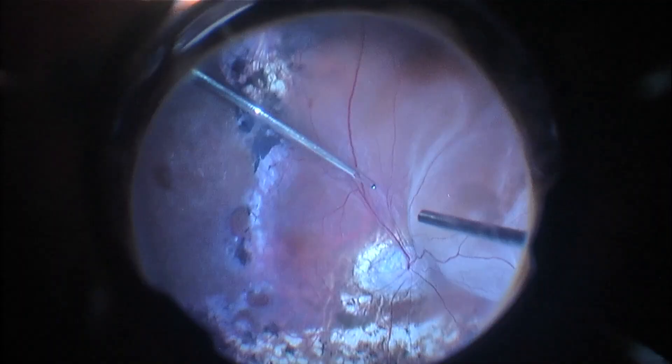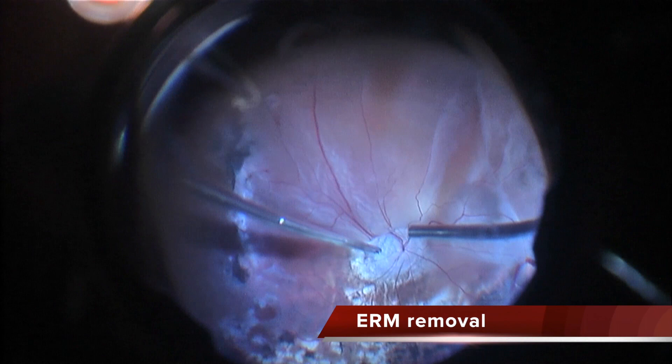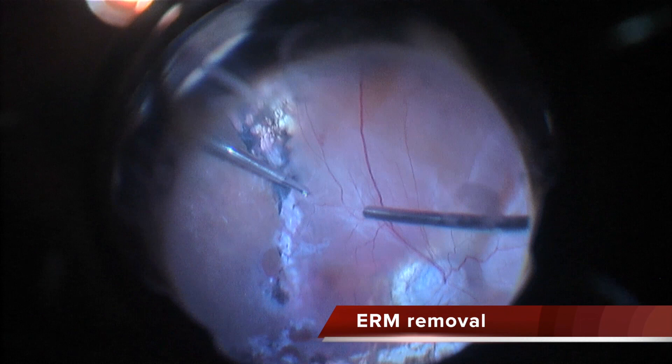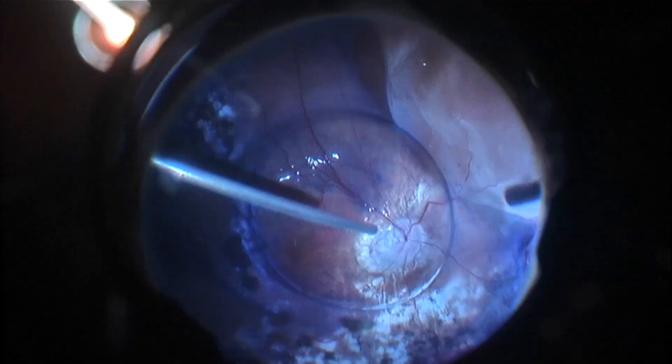In the inferior part of the retina, the retina is attached and there are still vitreous remnants. Unfortunately I cannot remove them without tearing the retina due to the laser scarring. I am removing the epiretinal membranes posterior to the vitreous base, but in the area of laser atrophy the membranes are so adherent that I stop pulling and just segment them.